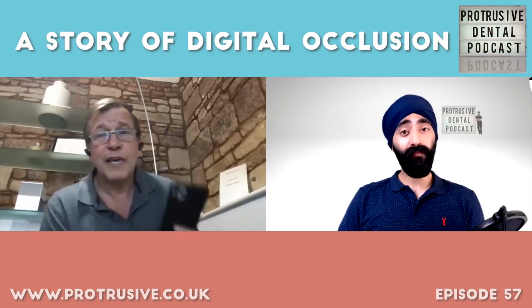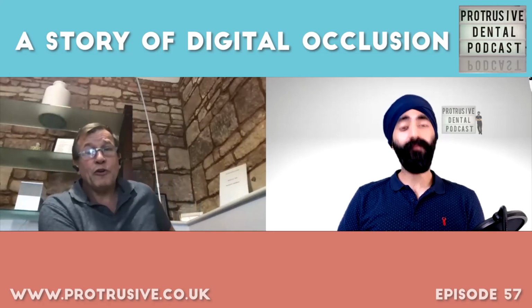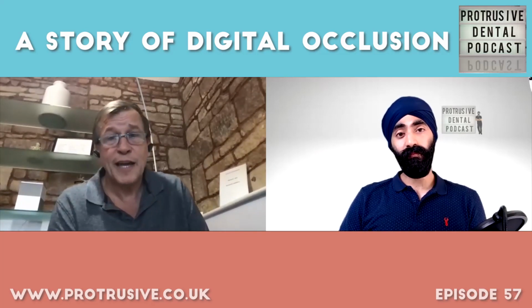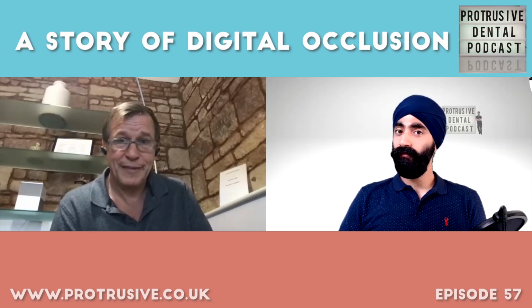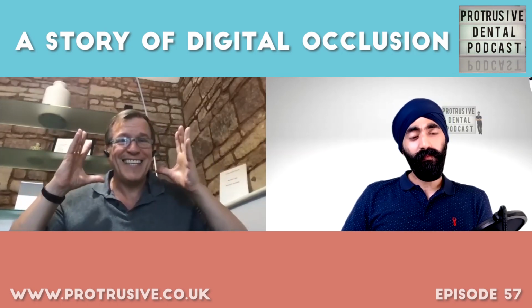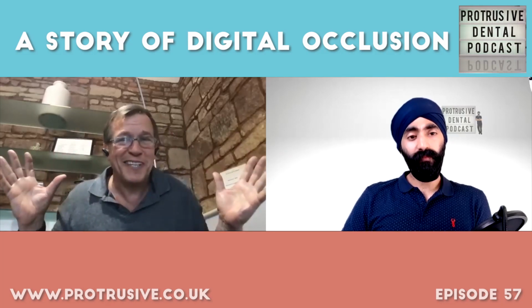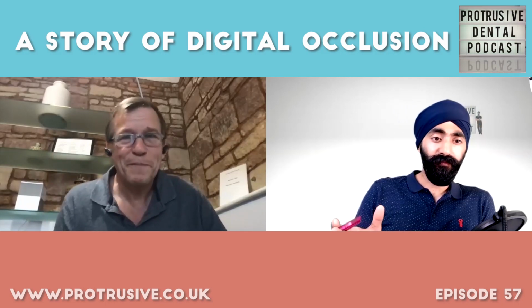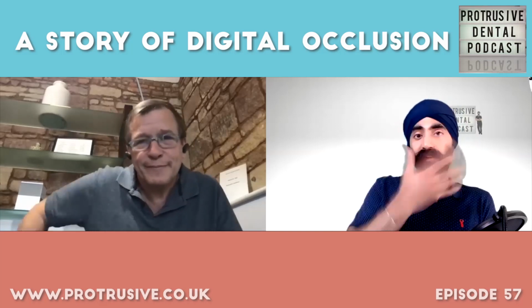And then we can use that, and with things like Bellis 3D, we can incorporate the intraoral scans together with CBCT scans into the patient's face, and we have a virtual patient. And now the technician can actually see the teeth sitting in the patient's face. I mean, that's amazing, isn't it? And when you think about that, essentially that is your face bow, right? Done.